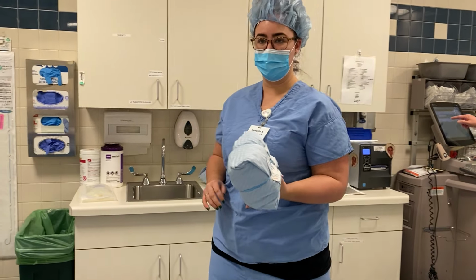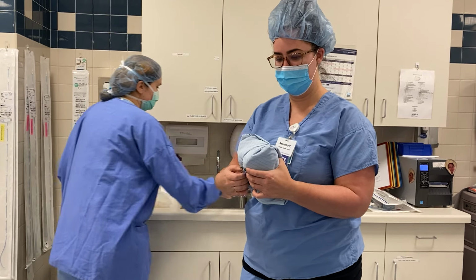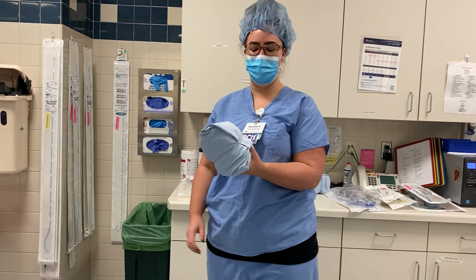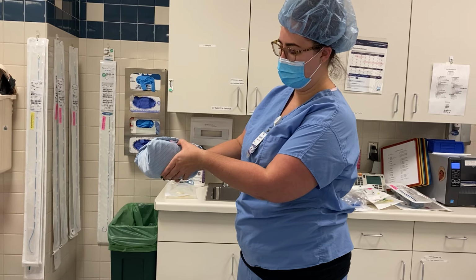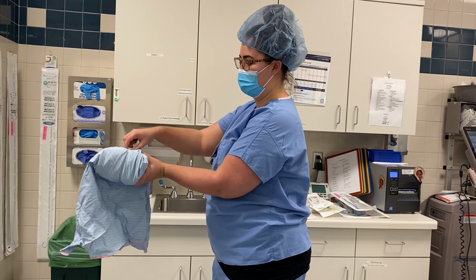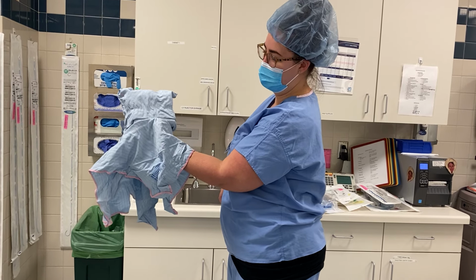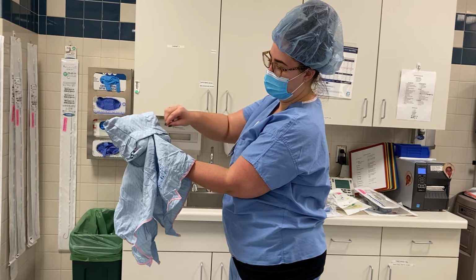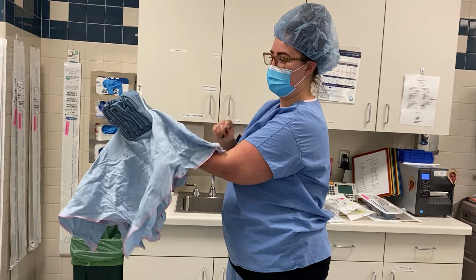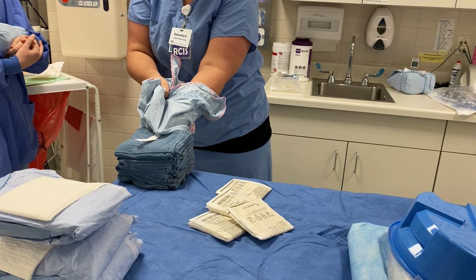Now at this hospital, we use reusable towels. They get sent to be sterilized between cases. So we need to open those towels. And we're going to open this package the same way that we opened the gowns. So we've got the flap here. I'm going to put my thumb underneath, and I'm going to open away, and then out to the sides, and peel this one back. And then these are double wrapped, so we're going to do the same thing. So there's another flap here. I'll stick my thumb under, and we'll peel away, and out to the sides, peel this one back. I'm going to gather everything up so that I can safely put it on the table.